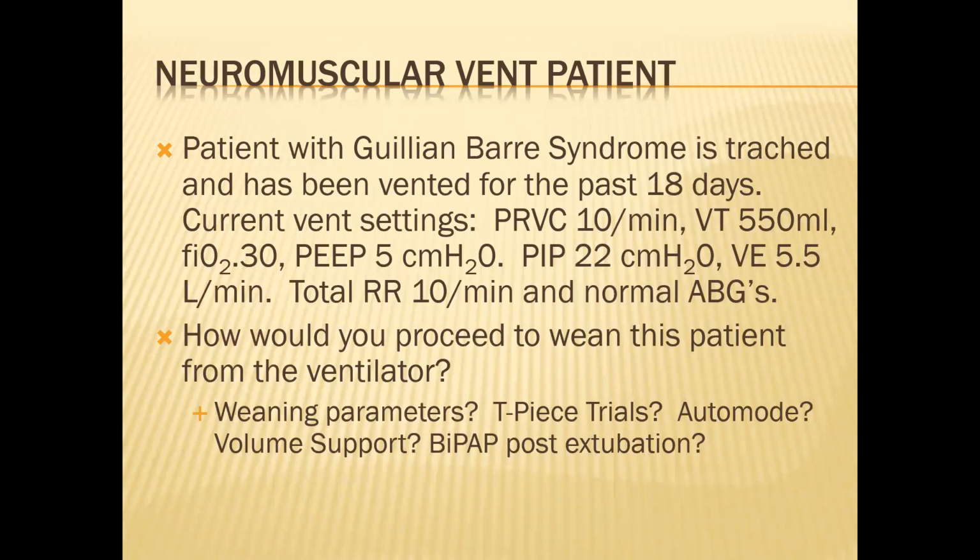So anything above 20 positive. So is -10 better? -10 is pretty weak, right? Yeah. So you want to see more negative than -20.